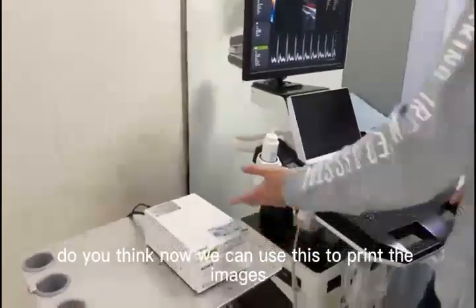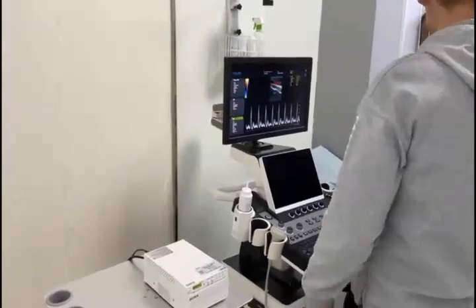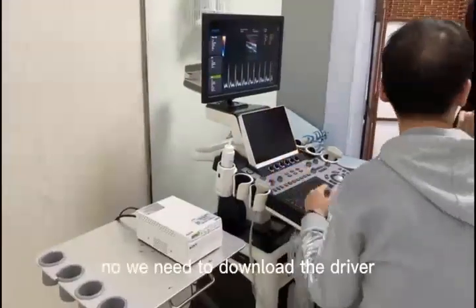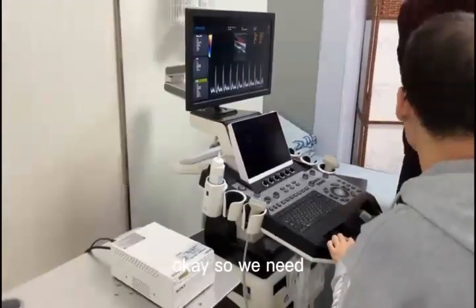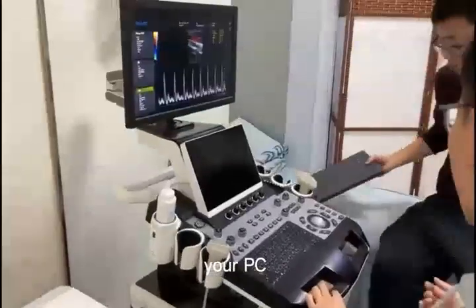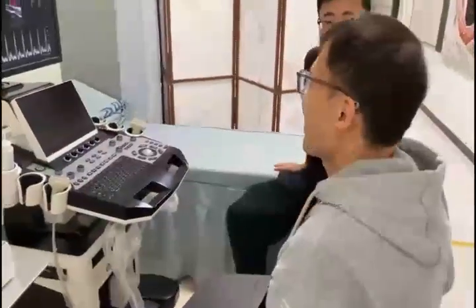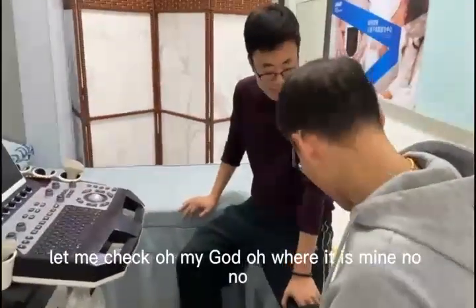Do you think now we can use this to print the images? Because we have connected the power and the signal? No. Why? We need to download the driver. Download the driver? So we need a USB computer? A USB computer. Do you have a USB? I don't have. Let me check. Oh my God, where is mine?